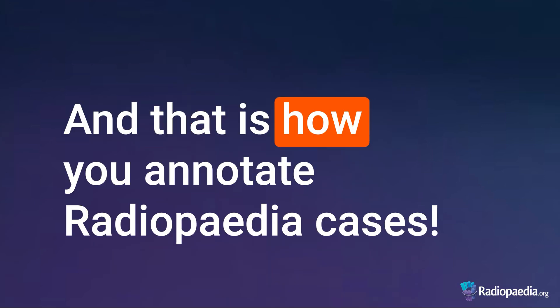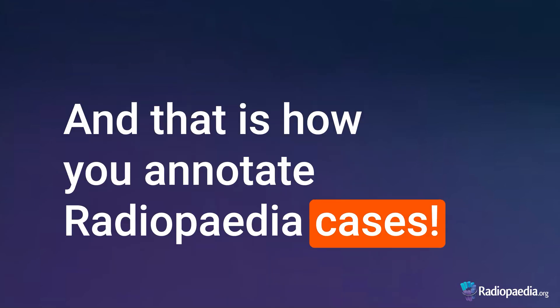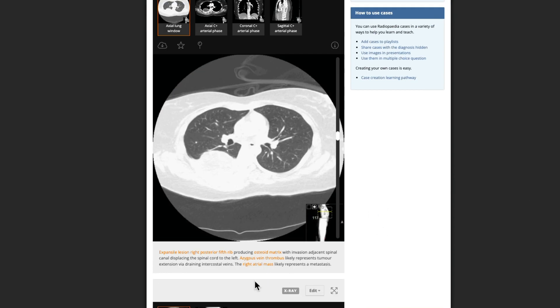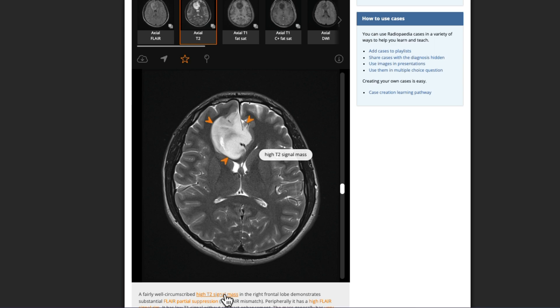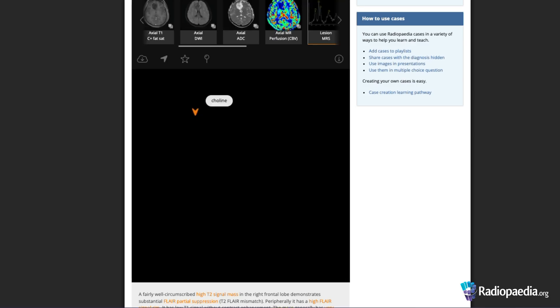And that is how you annotate Radiopedia cases. Annotations can have multiple arrows either in the one image or in multiple adjacent images. An annotation can include more than one arrow, which is useful to outline a larger mass or structure or multiple similar lesions.